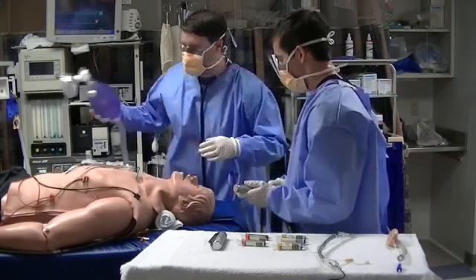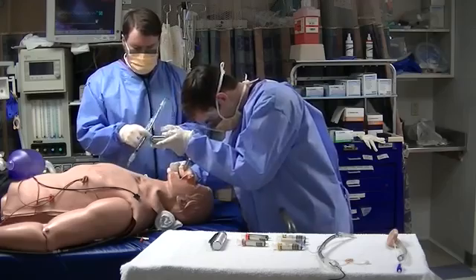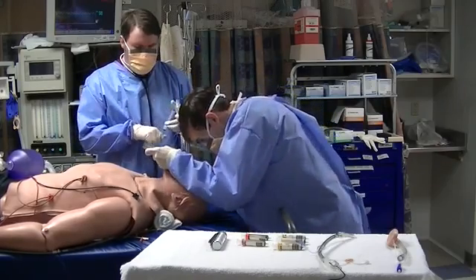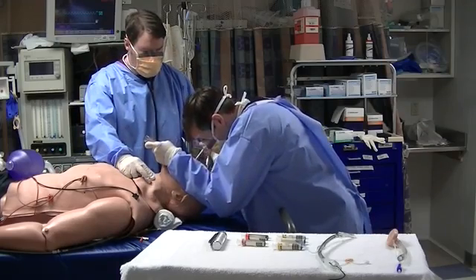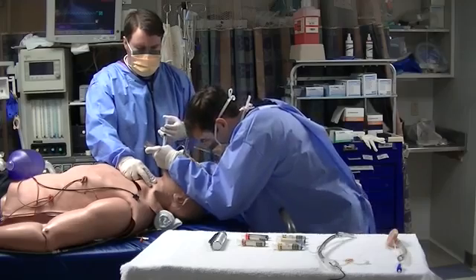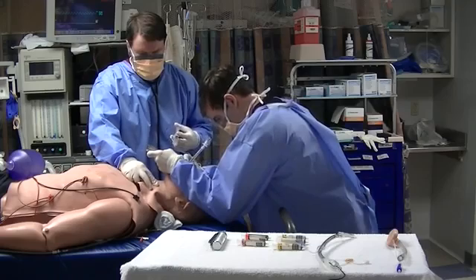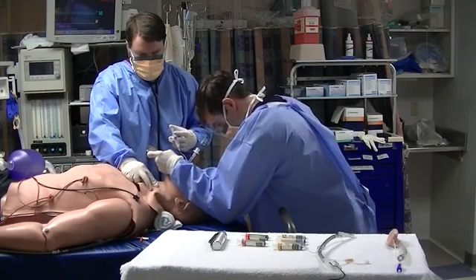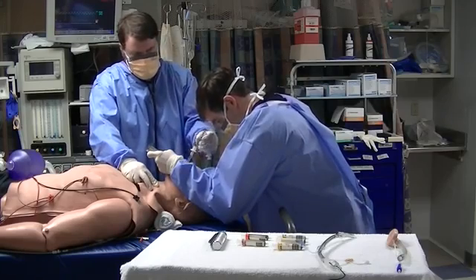Once the provider has adequately pre-oxygenated the patient, he uses his right hand to pry open the mouth and inserts the laryngoscope smoothly using his left hand without hitting the patient's teeth. He then visualizes the vocal cords, and keeping his eyes on the vocal cords, grabs the ET tube and smoothly inserts it. For most adult patients, the ET tube should be placed at a depth of 21 to 24 centimeters, which are marked on the ET tube itself.